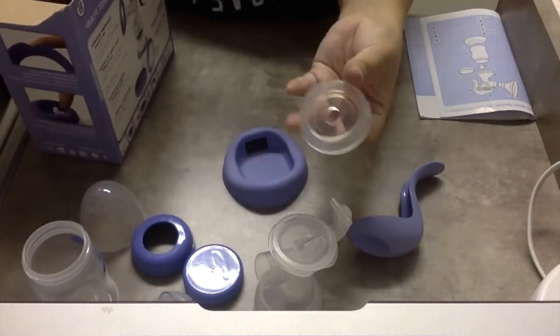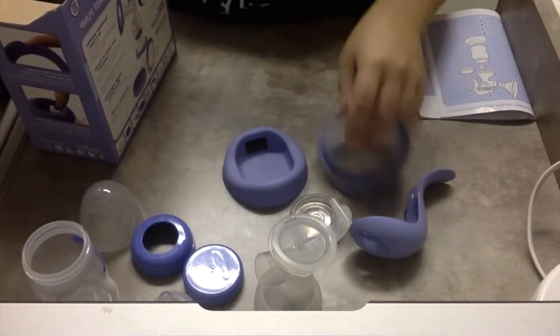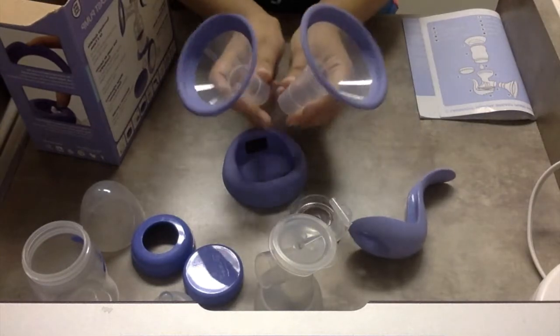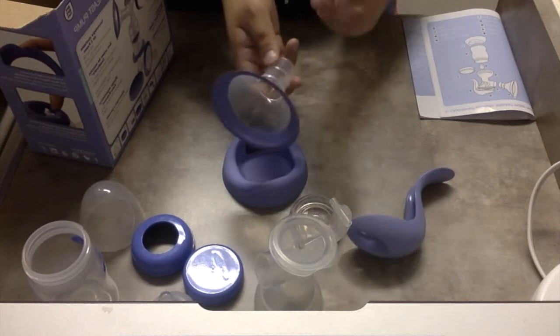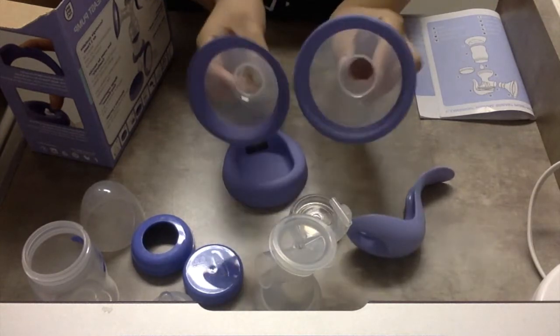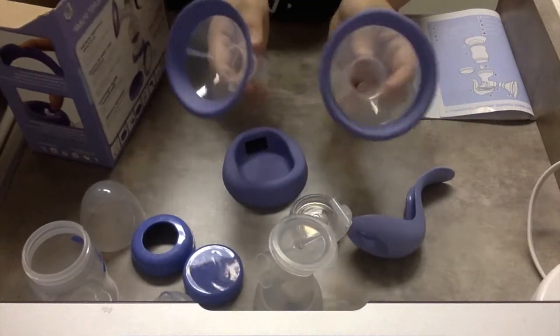And then this is a silicone diaphragm. And then it actually comes with two different flange sizes which is great. So just in case one isn't a great fit you can use the other one. It does have the cushioning around to make it more comfortable around your breast for when you're pumping.